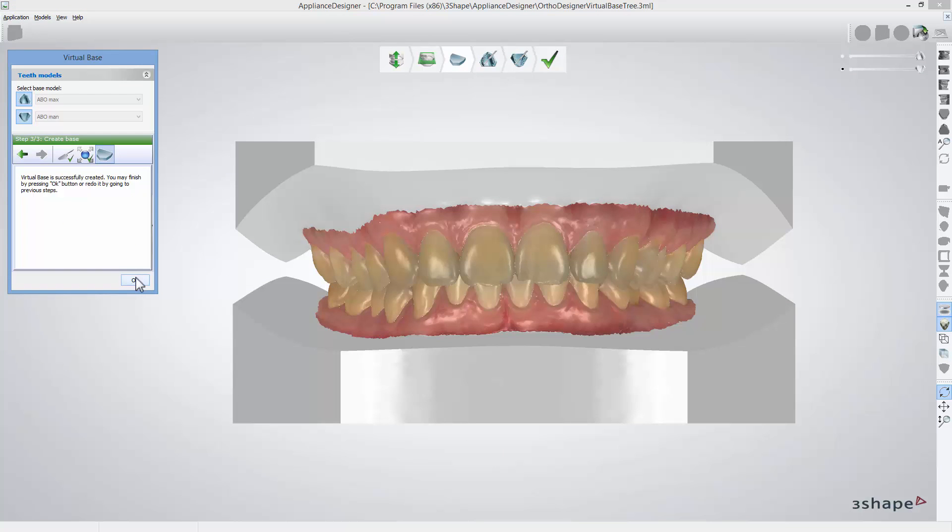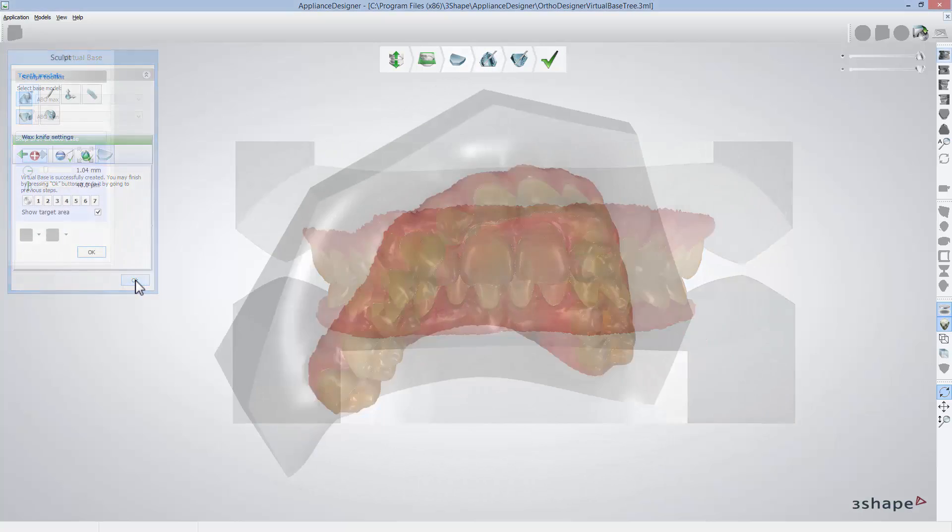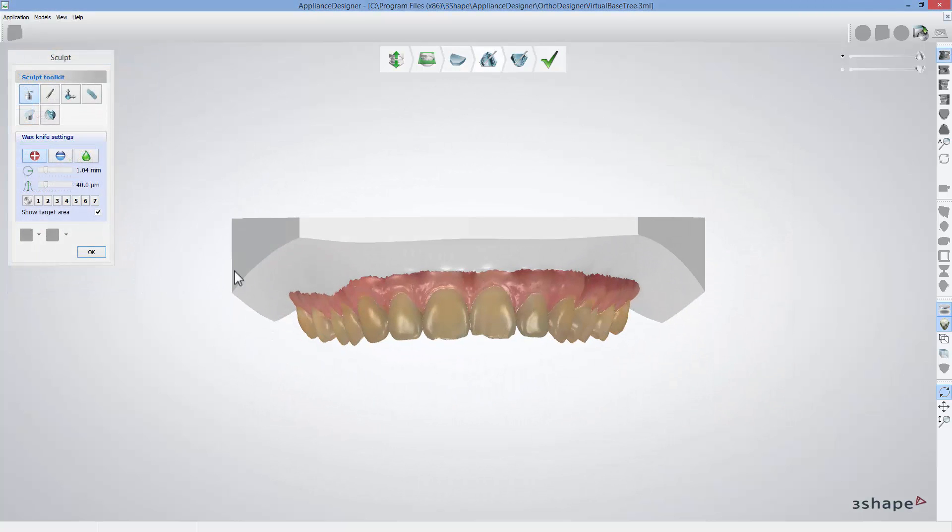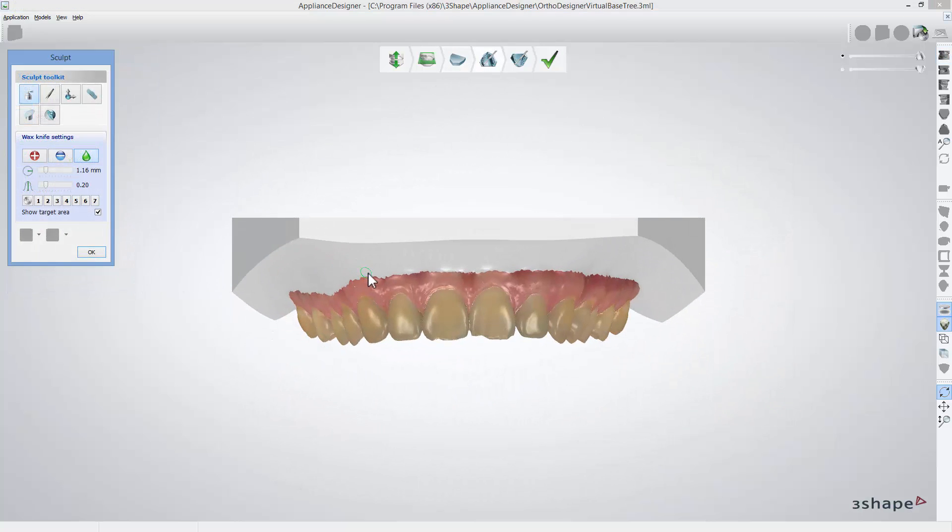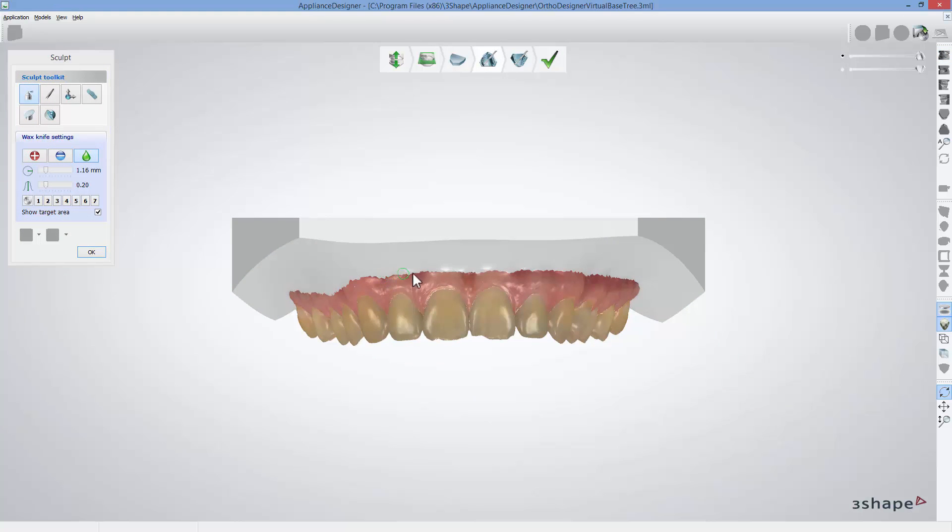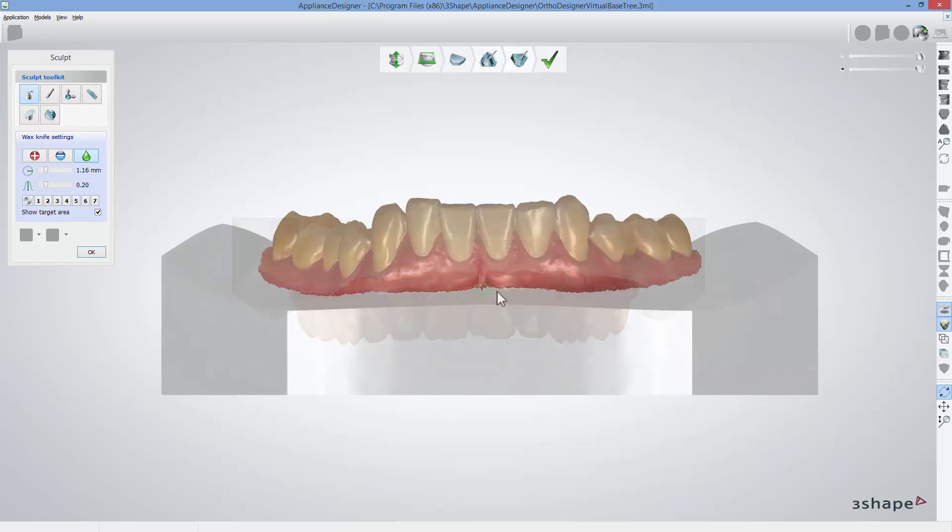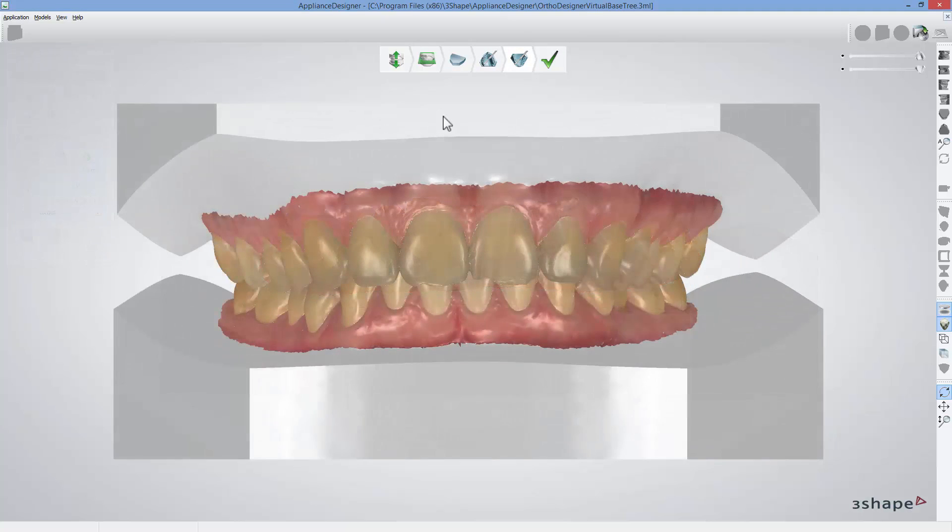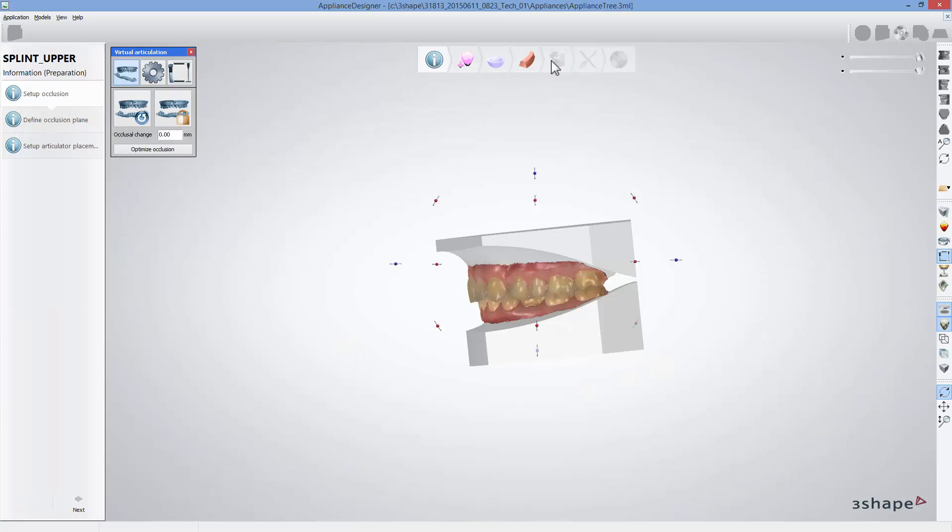The software creates the virtual base. If you need to adjust the models, click OK to get to the sculpt step where you can adjust the models upper and lower respectively using sculpt toolkit. When you are done, click finish on the workflow bar.